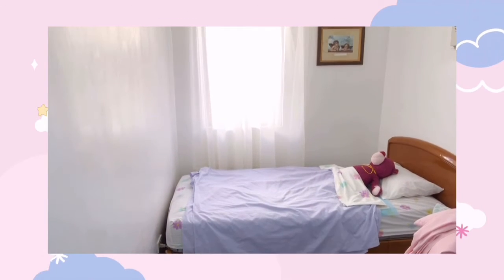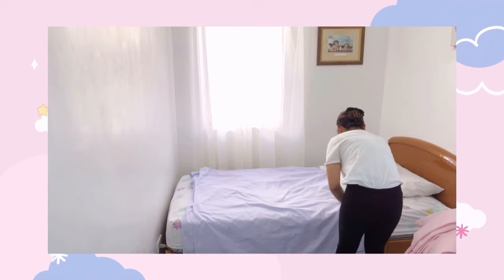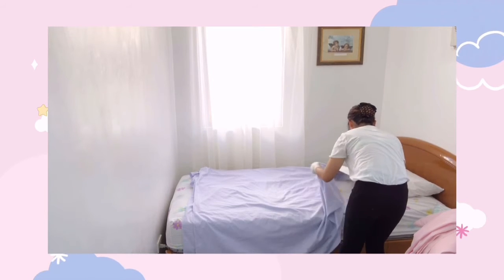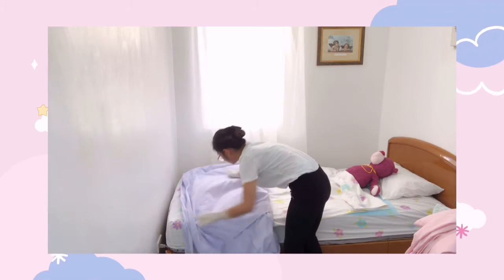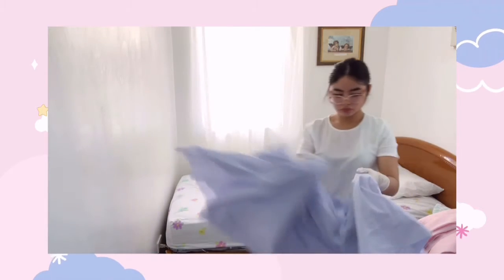Third, you're going to remove the top sheet and blanket. Loosen the bottom sheet at the foot and sides of the bed. Client may be covered with a bath blanket. This facilitates easy removal of linens. Bath blanket prevents exposure and chills.